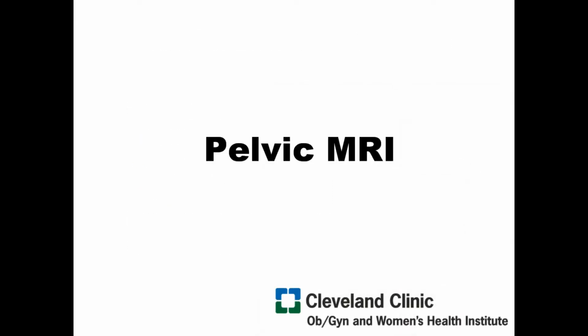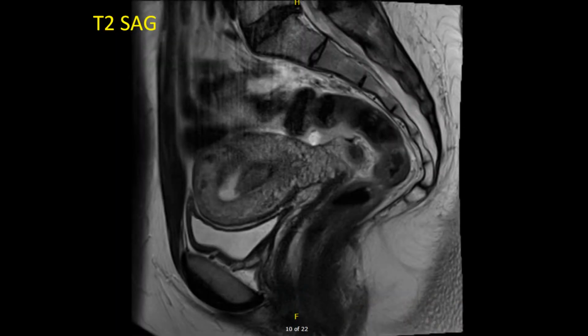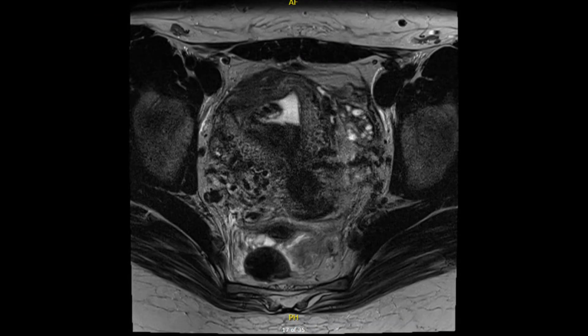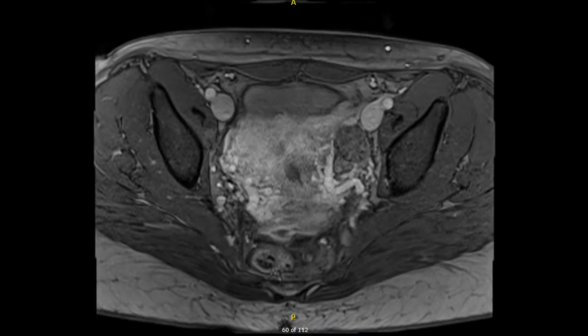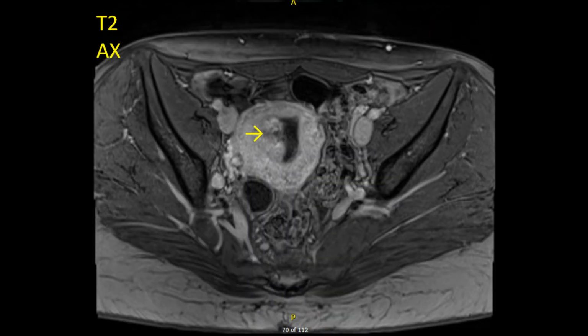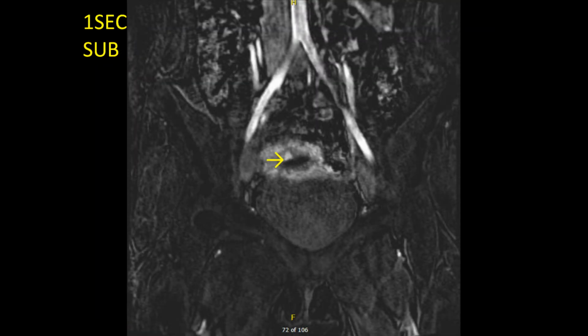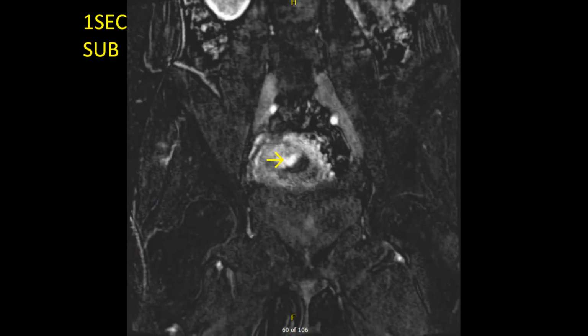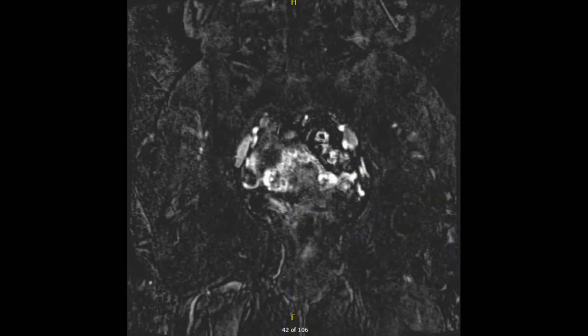Given the fertility concerns, the diagnosis was confirmed with MRI-MRA, which identified a 2.7-centimeter mass-like process with early post-contrast enhancement in the arterial phase. T2-weighted images demonstrated tubular flow voids along the right lateral fundal myometrium, forming a 2.7-centimeter mass-like projection into the right anterolateral myometrium. Post-contrast coronal images demonstrated early enhancement in the arterial phase with asymmetric filling of the right gonadal vein, clinically consistent with the enhanced myometrial vascularity.